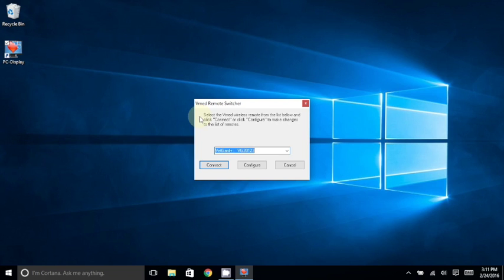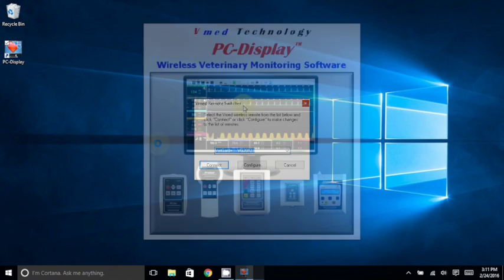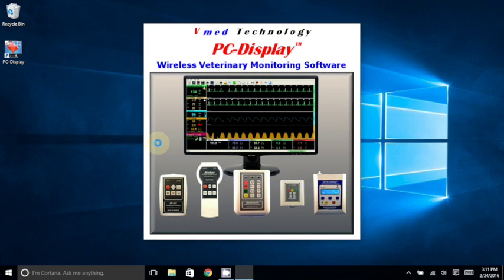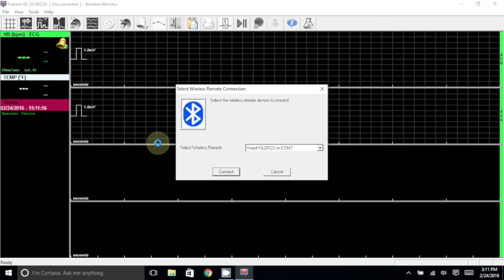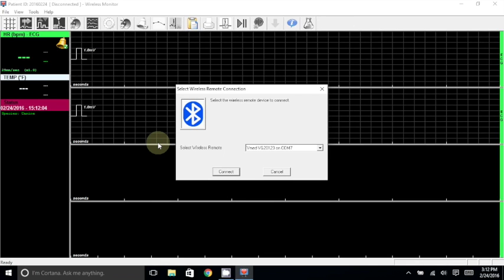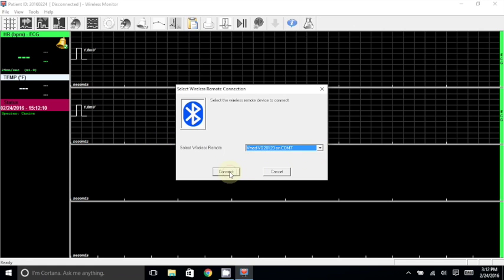If you had to previously configure PC Display for internal Bluetooth, then you will see the smaller VMED remote switcher window here. Otherwise, you'll see PC Display open in full screen with a select wireless remote connection window in front. In either case, make sure that your VMED remote that you wish to connect to is selected in the drop-down box, and then choose Connect.